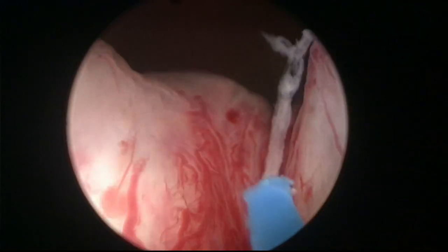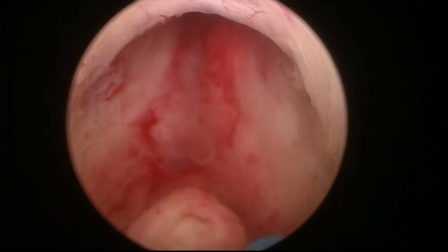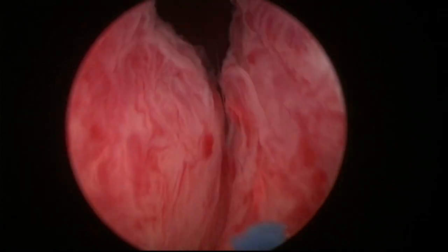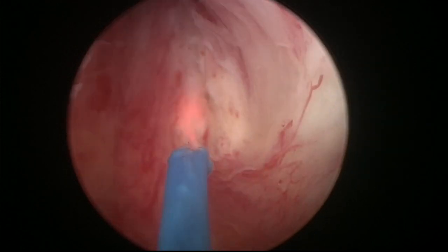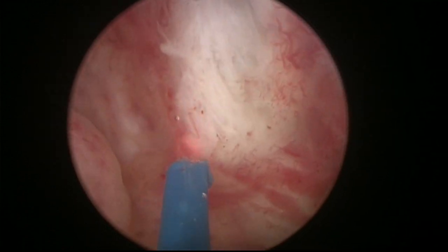My favorite setting is to use two joules and a frequency of 40–50, depending on the machine you use. Typically when we did the original three-lobe technique, we would start doing incisions in the bladder neck straight ahead, but I'm going to recommend you to come down here and mark the limit of the sphincter. This is what I call the white line, and it will serve as a reference during the procedure.